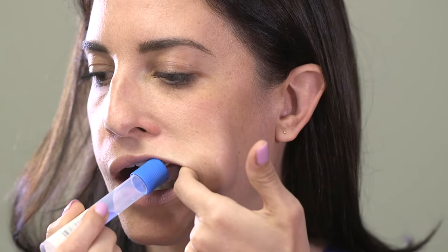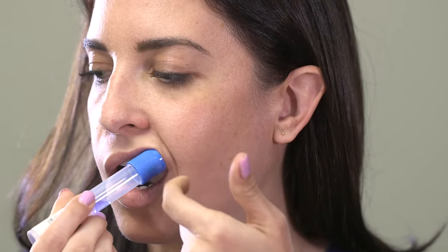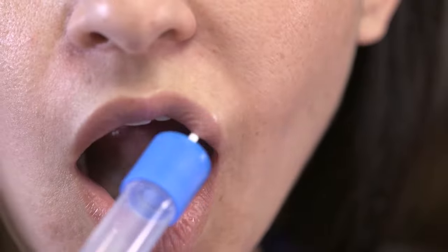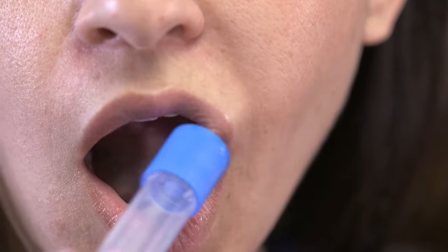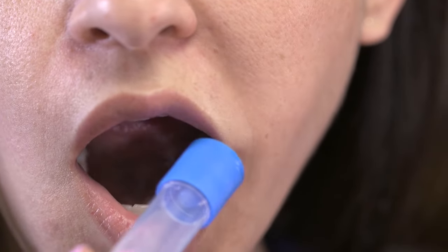Move the sponge to the upper portion of the left side of the mouth, in the space where the upper gums meet the cheek. Repeat the scraping motion in the upper part of the mouth at least 10 times.